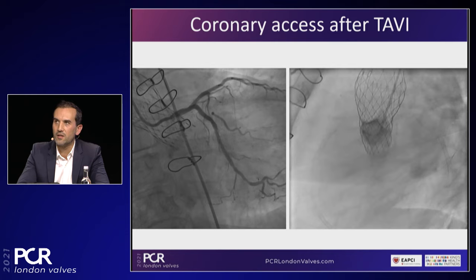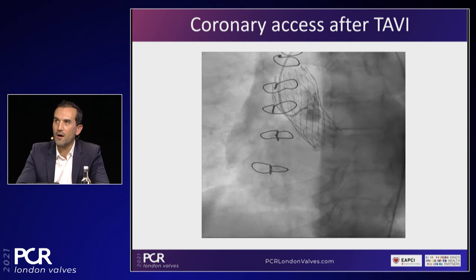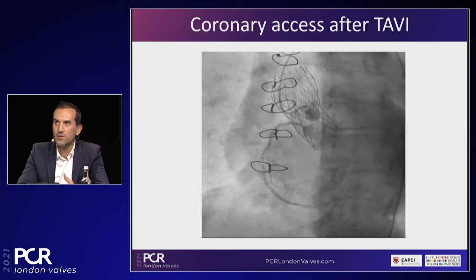This example may be more extreme, but illustrates the overall philosophy. A patient having an NSTEMI years after TAVI and a bypass graft on the LAD, and you see at the time of looking for the right, we don't find it. By aortography and therefore unselective catheterization, we finally find that the right is perfused by a small communication between the ascending aorta and the right vessel, in a location that is not at all physiological. Quite anomalous.